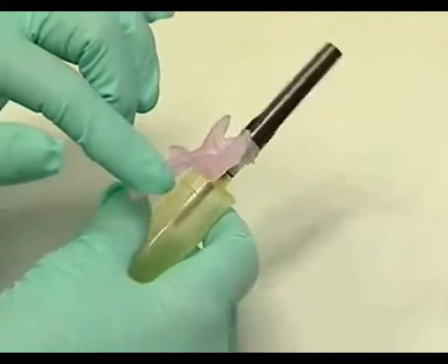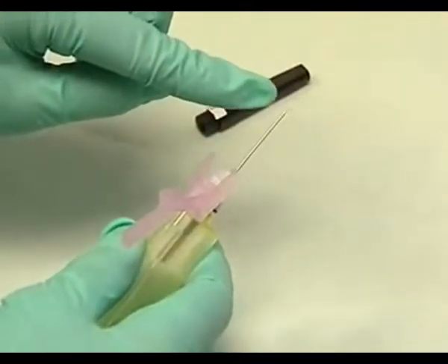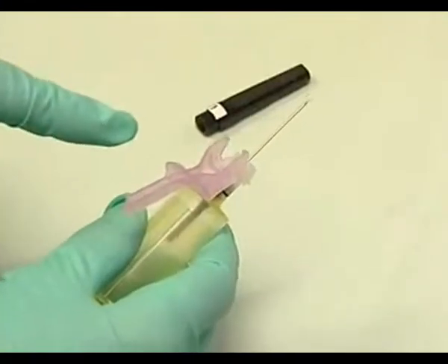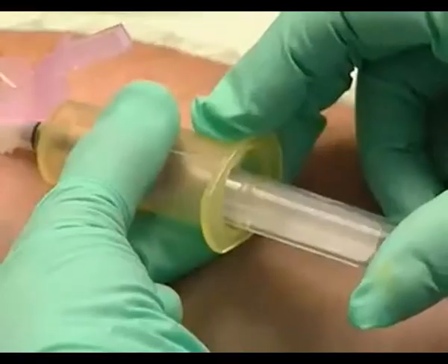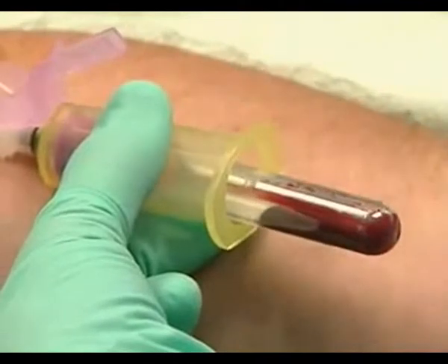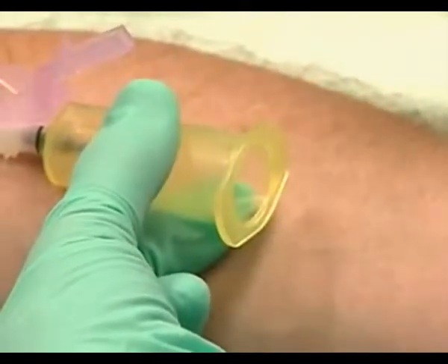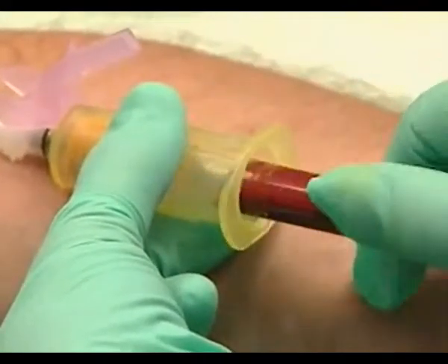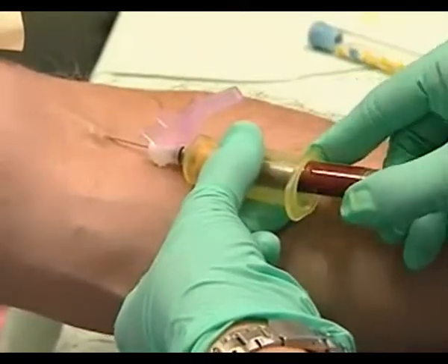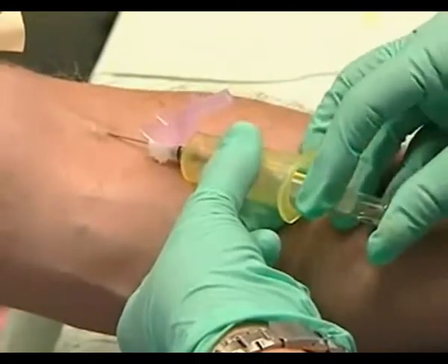Insert it into the yellow vacutainer and screw it into place. Then lift the needle guard and remove the cap. You'll see that the hole in the beveled edge of the needle is facing up and is in line with the needle guard. Take a shallow approach to the vein — the blood flashing back into the vacutainer confirms you're in. We're drawing a couple of tubes for the lab. Gently oscillate the tube to mix the blood with the heparin or stabilizing agent in the tube. To switch tubes without causing the patient discomfort, steady your hand against the arm, then pop in the next tube without pushing the needle any deeper.